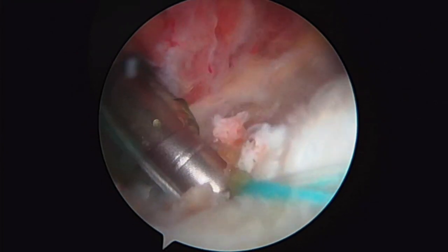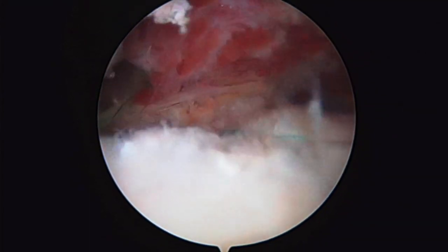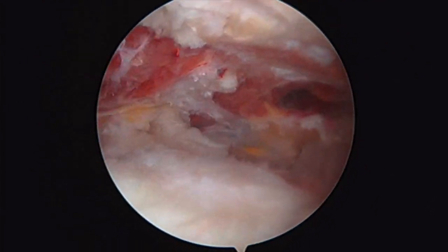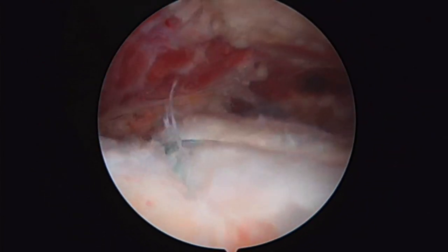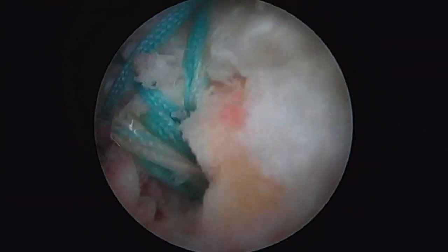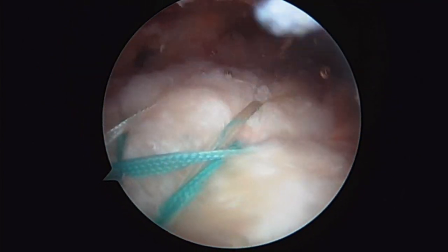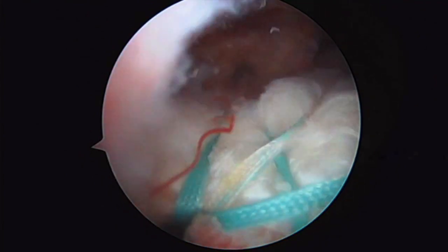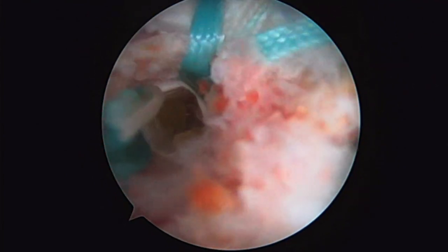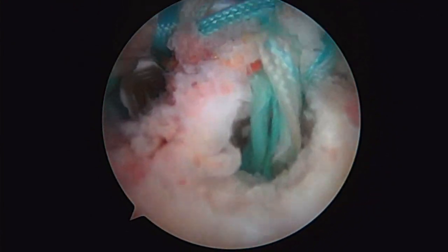We're going to lock the suture. And there's the repaired cuff back down to bone. Decompression done. We'll show you what it looks like through the lateral portal as we come into the shoulder. There it is — double row reconstruction. Those hollow architecture anchors are allowing bone marrow to leak up into the cuff. That looks good.